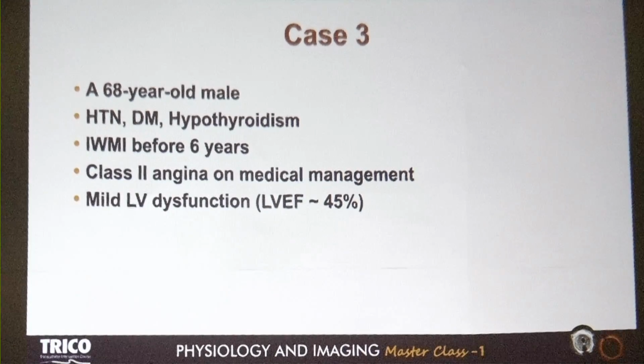Can we just ask Dr. Akasaka, how often do you see this? I mean, this is concerning that IVUS looks so similar to calcification. Yeah, very thick fibrous plaque sometimes looks like calcium, right? So, as Dr. Patel said, if we have a combined IVUS and OCT, then only can we clearly identify.